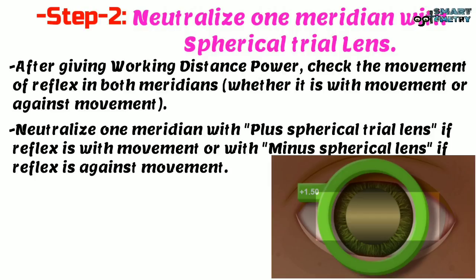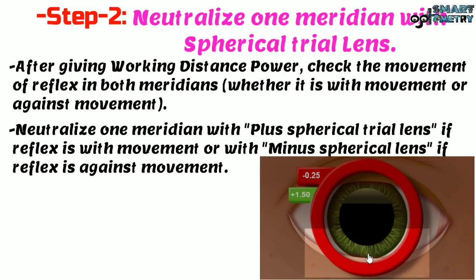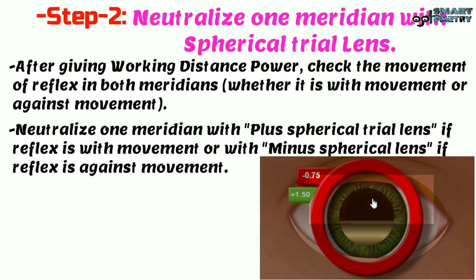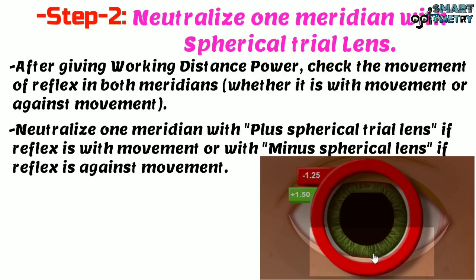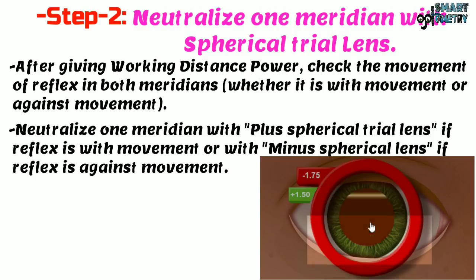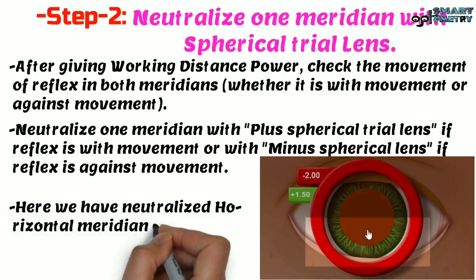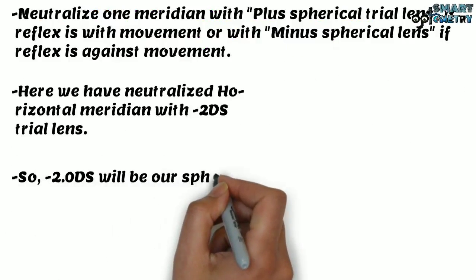Starting with minus 0.25, the reflex is still against movement, so we increase the minus power in increments of minus 0.25. Continuing to add minus 0.25 increments, the reflex remains against movement until it finally gets neutralized. We have neutralized the horizontal meridian with minus 2 diopter spherical trial lens, so minus 2 diopter spherical will be our spherical power.